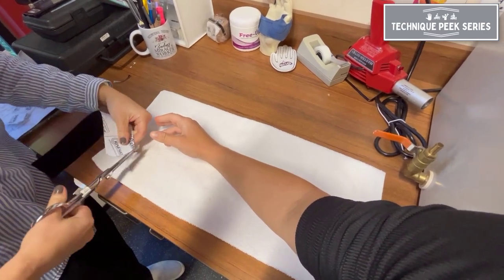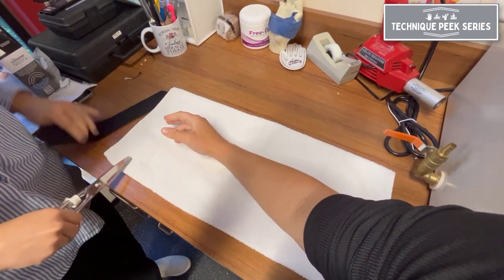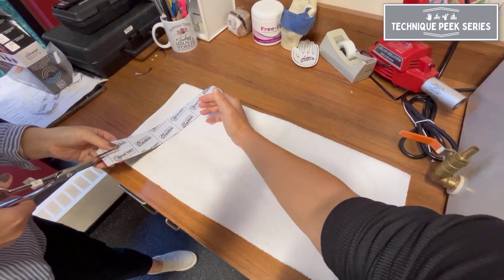To measure your piece, you're going to measure from the ulna to the tip of the thumb with the wrist in neutral and the elbow in neutral.